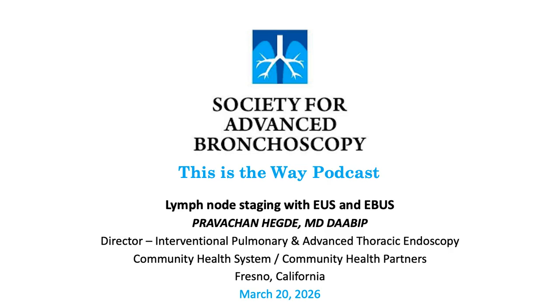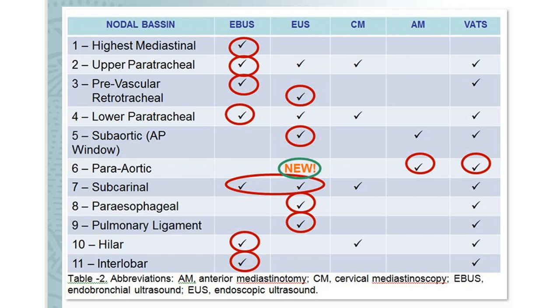It's an absolute pleasure to have you on the podcast recording, Dr. Hegde. And you have a unique skill set in being able to sample a lot of challenging lung nodules and nodal stations. So maybe for our audience, you could go through why would a clinician want to combine both EBUS and EUS? Why are they complementary techniques? Great question. Adding EUS and EBUS, they're not competitive techniques. They are complementary to each other.